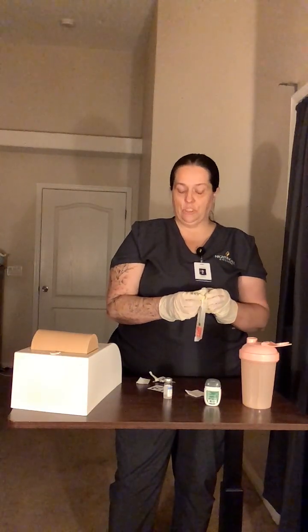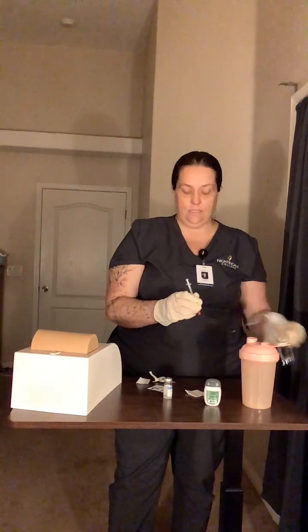Just like with any injection, there could be some stinging or burning at the injection site. Subcutaneous injections are normally done in the abdomen, in the thigh, or in the back of your arm. Today we are going to be doing it in your abdomen. So I'm going to put this down to 1 mL because that's what we're doing.